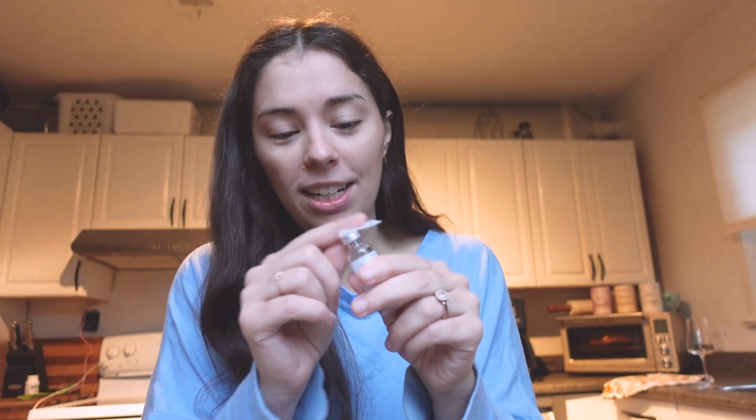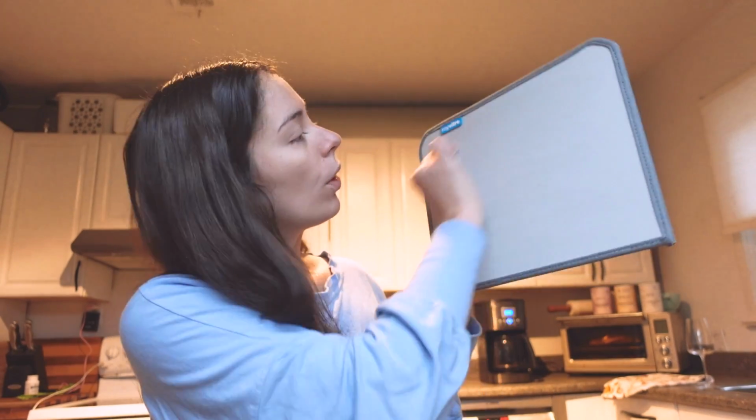Needles. Tip number one, stay organized. I find it is so much quicker to do this whole process when I have something like this and it's all organized and laid out for me, rather than having to dig around in a bag and find all the things. Just having it all laid out makes the process go a lot quicker. So right now I'm just sanitizing the top of my bottle because you've got to every time, and then I'm just going to wipe down my injection mat. There's Elsie drinking. Okay, step one, done.